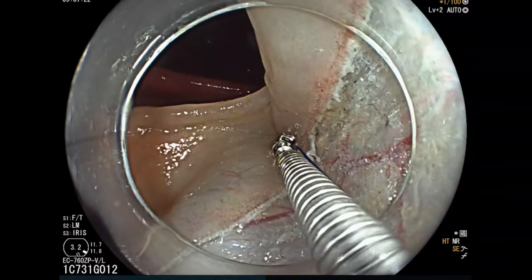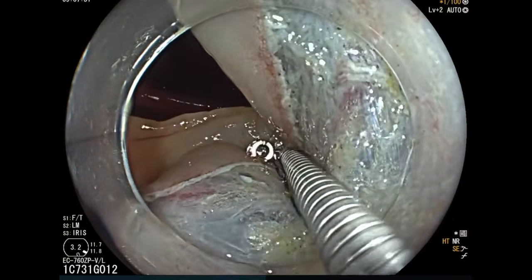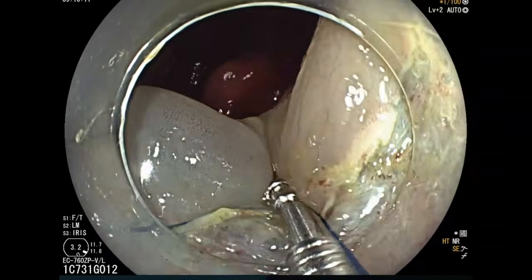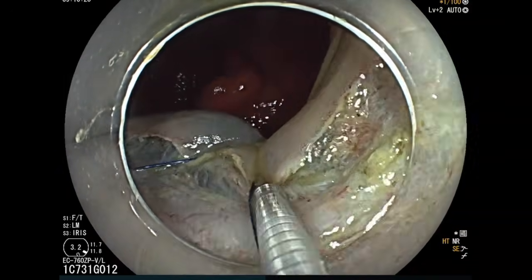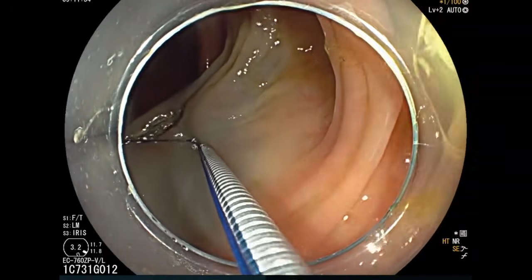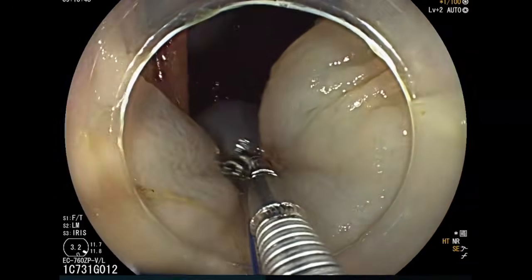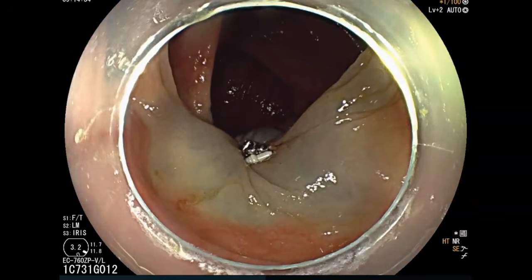For closure of this large mucosal defect, we prefer to use through-the-scope suturing devices, which is our institutional practice for these large mucosal defects. However, clip closure can also be considered, as the main goal is to approximate the mucosal edges to each other. We used a zigzag method when applying each helix, and that allows for closure of the maximum part of the mucosal defect. And finally, we use the cinching device, and complete closure is seen here.